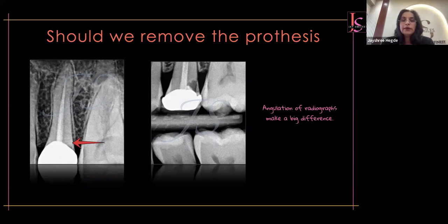Now, when you take this bite wing, you know for sure you need to do many things in this region. You need to restore 2.4, you have to do a distal DO there because the previous dentist has nicked that tooth. You need to do a MO in 2.6, and you need to remove the crown over here and then redo the crown because there is a loss of tooth structure in that region. And that is why the patient has been constantly complaining of food lodgement in this region.